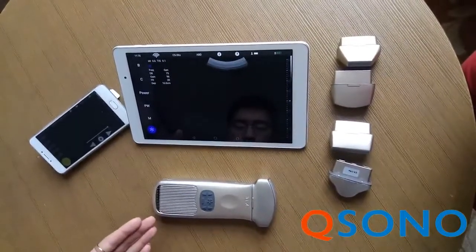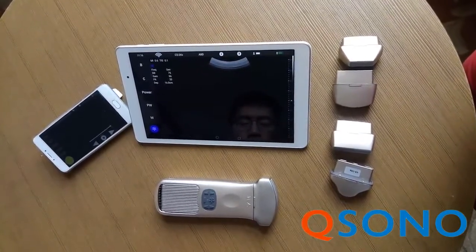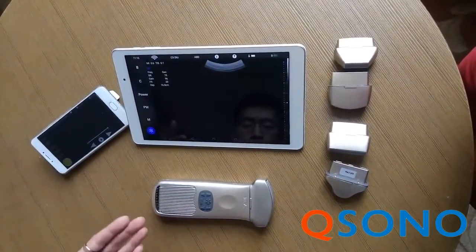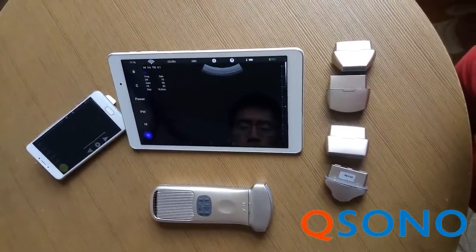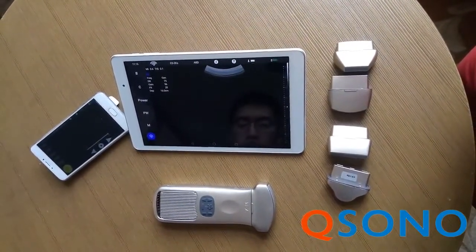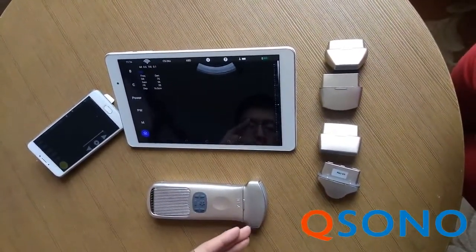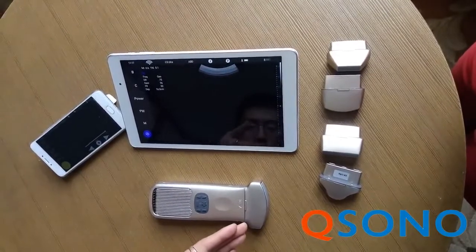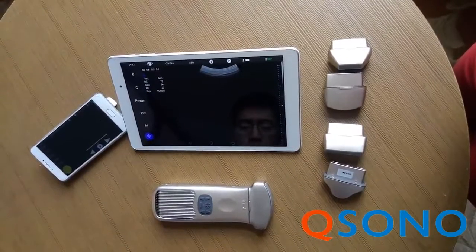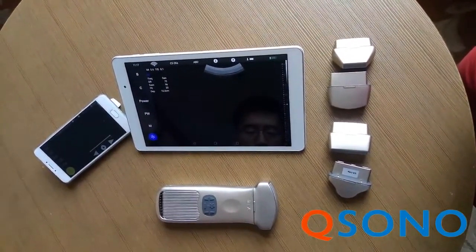Here is our wireless pocket ultrasound system. It's an innovative pocket-sized ultrasound scanner with Wi-Fi capabilities that helps to realize ultrasound anywhere — wireless freedom from Windows to Android to iOS, but never compromising on image quality. The weight of one unit with one transducer head is around 300g, equivalent to two baseballs. Dimensions: 117 x 55 x 25 mm.